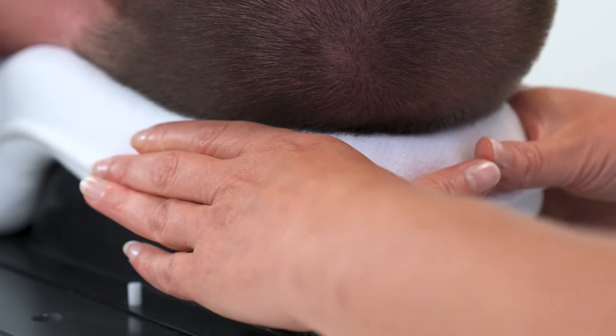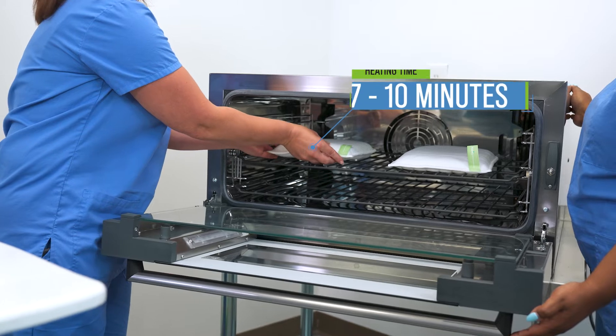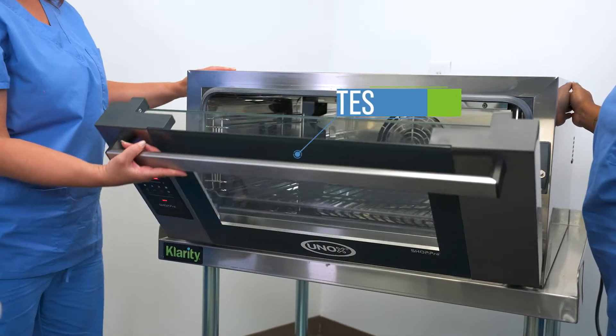The best way to prepare your cushion is to place your Clarity Cushion directly on the oven rack. The Clarity Cushion can also be placed in a water bath in the plastic packaging.